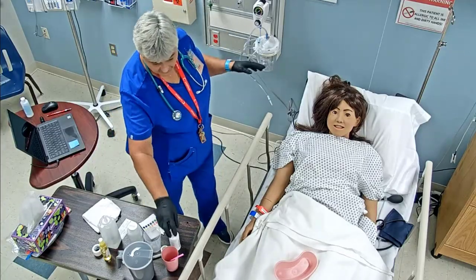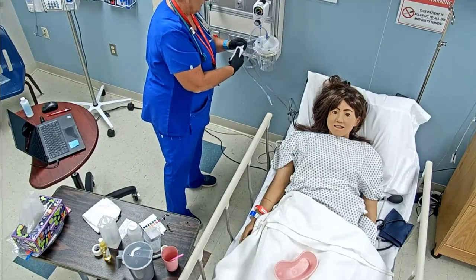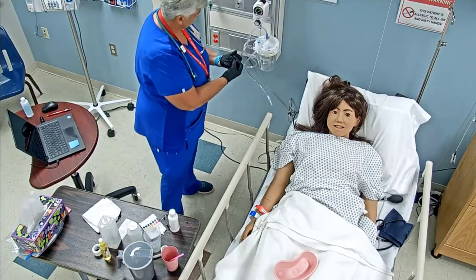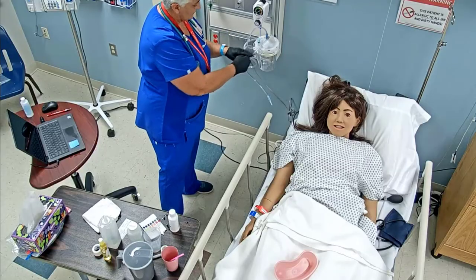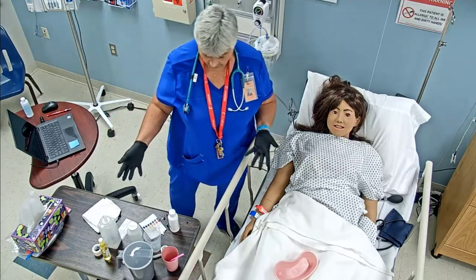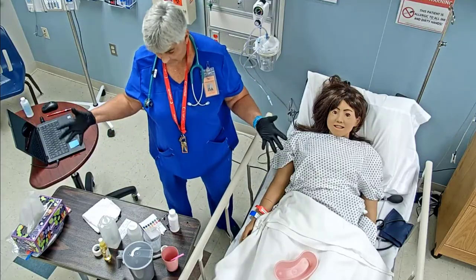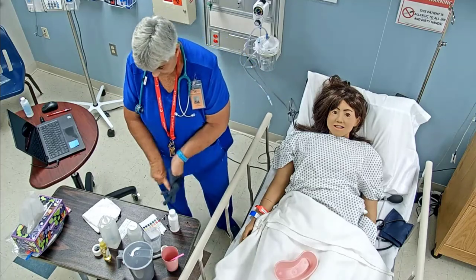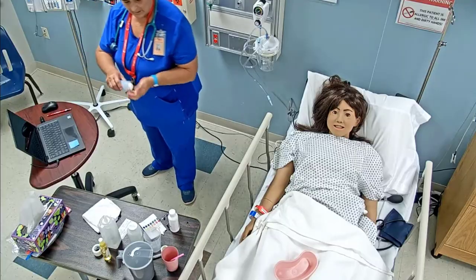So once I've done all that, I'm going to use my solidifier, open the lid, put the solidifier in there. The solidifier makes it a gel, like Jell-O, so that whenever you unhook everything and put it in your biohazardous bag or whatever the hospital's policy is, it's not going to go everywhere. So glove to glove, skin to skin, again do a medical hand wash.